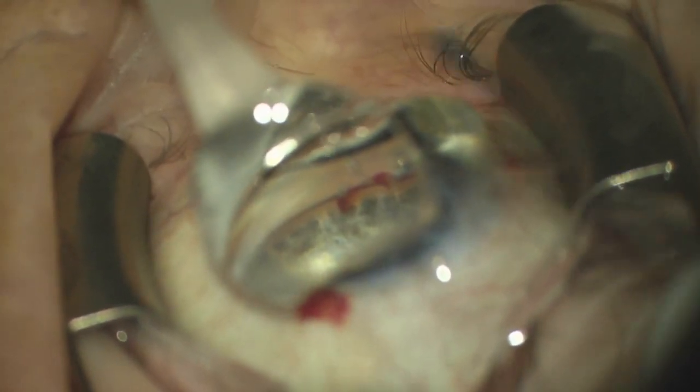In addition to doing a precision goniotomy, we're going to hold down the button and use the cannula to extend that goniotomy laterally, as part of the versatility of this procedure.